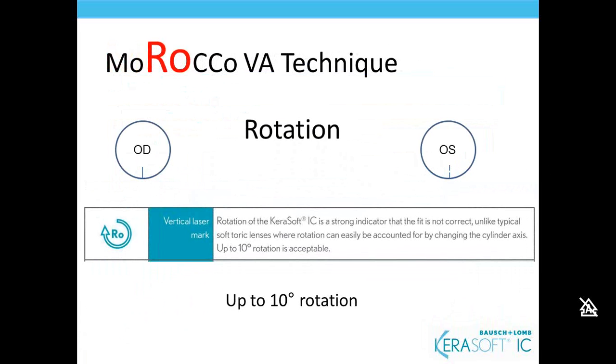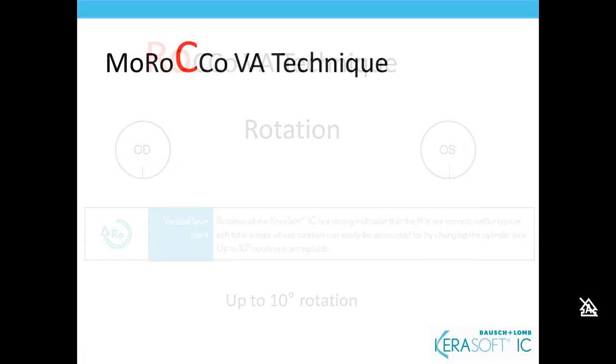So if I see some swinging rotation, I'm expecting that the lens is also going to be moving well over 1.5 millimeters, probably more than 2 millimeters. So again, a swinging rotation with excess movement is suggesting that the lens is pretty loose. Conversely, if you see minimal movement, you're not going to see that rotation moving in an unstable fashion. It's going to be locked on somewhere. And traditionally, if the lens is too tight, you won't actually see that marking at 6 o'clock. Sometimes you will, but it might lock on in a different position.